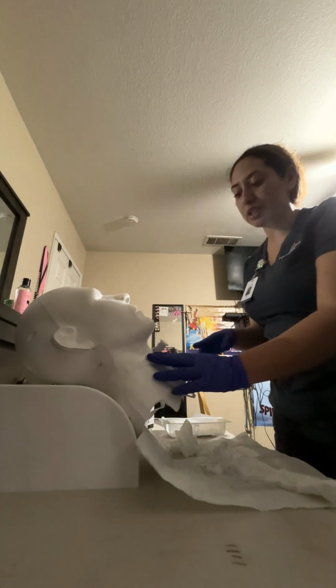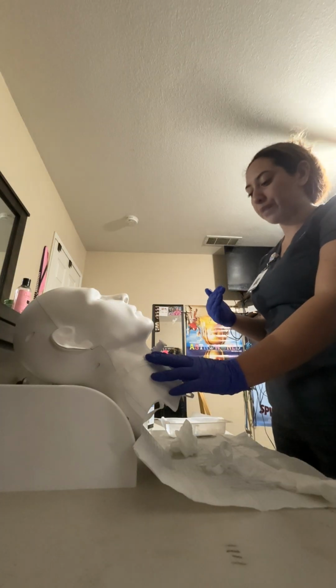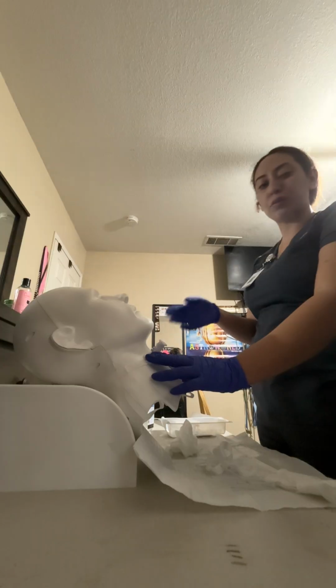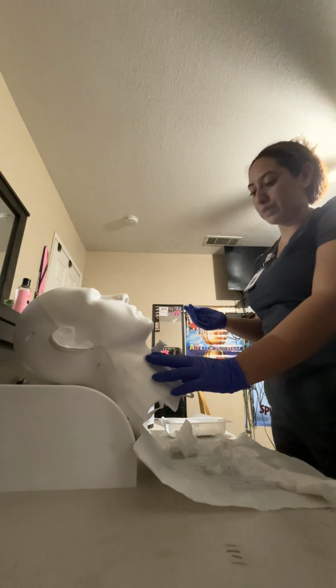The reason that we use 2 persons to do this step is to prevent dislodgement of the tracheostomy. Okay, for this video, I will use my second hand to do that, but if this was a real scenario, I would have my second person come in and help me with this part.